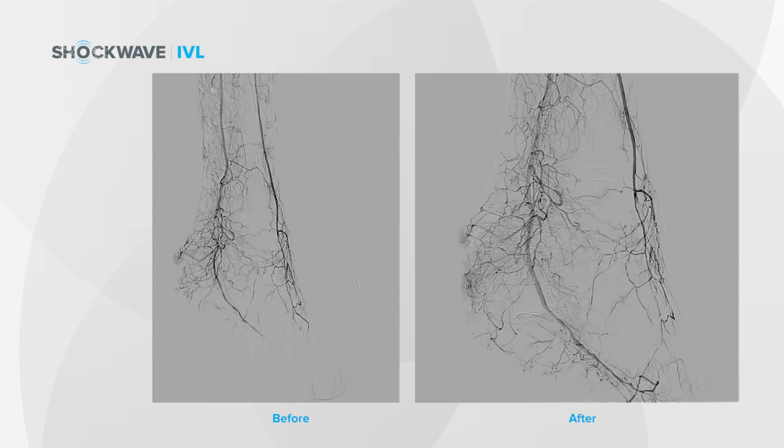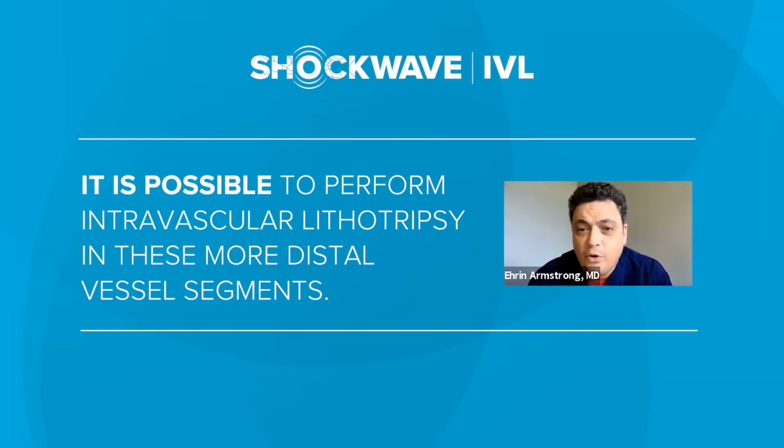So I think this case really speaks to the importance of treating directly all the way to the level of the occlusion and to get straight line flow to the wound, and the fact that it is possible to perform intravascular lithotripsy in these more distal vessel segments.